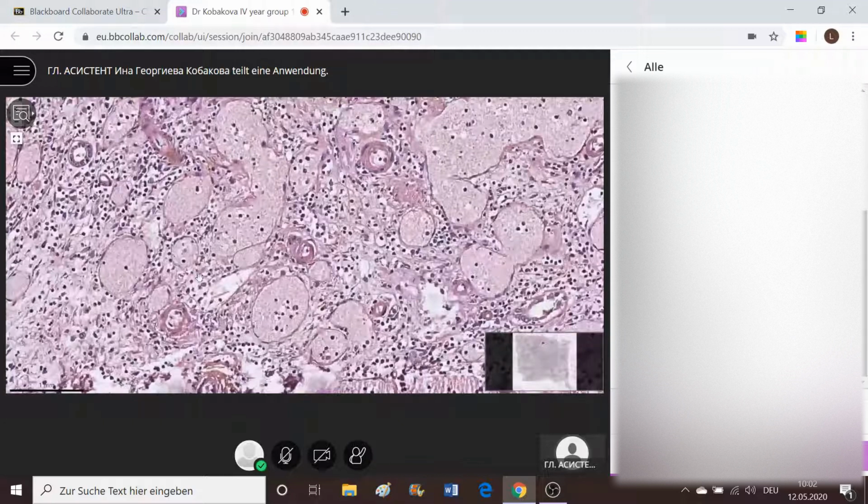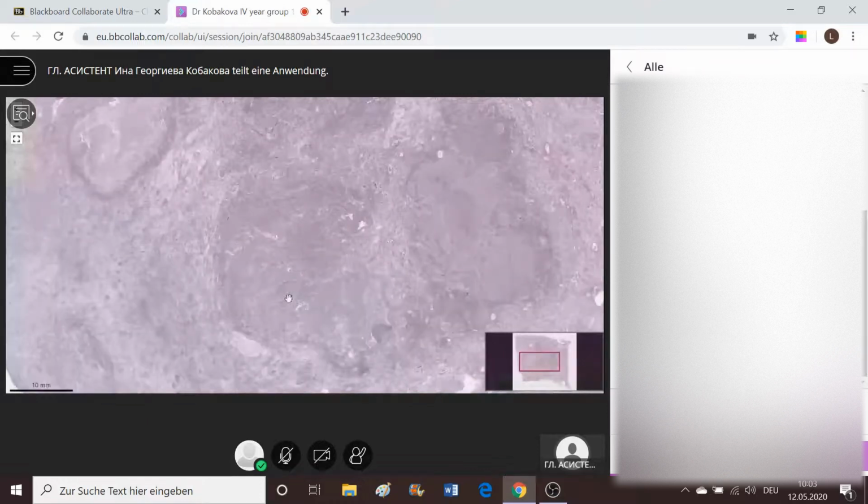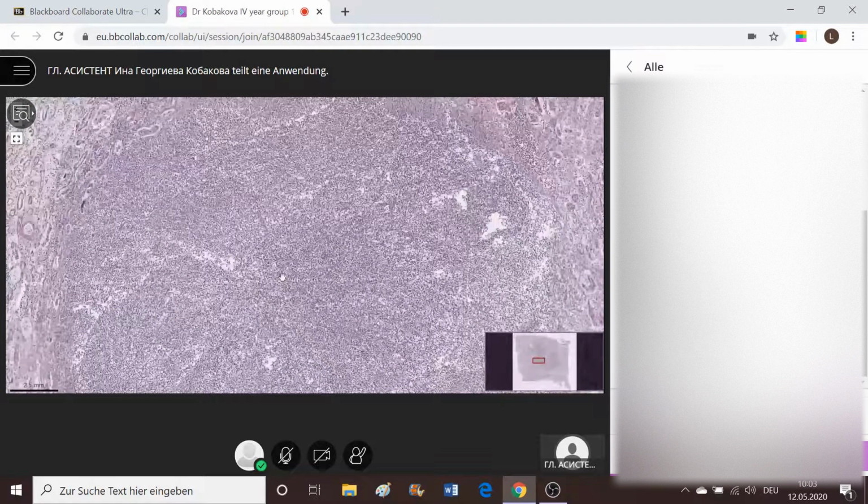Here, what we should observe would be interesting at a smaller magnification. You may describe 3 specific fields, 1, 2, 3, and others surrounding them, which are filled with glomeruli, inflammatory infiltrate, but majorly these huge fields appear pretty much acellular, circumscribed by something like a pyogenic membrane, and the inflammatory infiltrate inside is merely made of lots of which type inflammatory cells? Leukocytes.